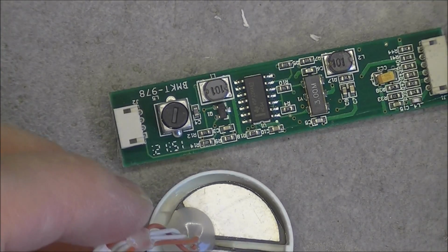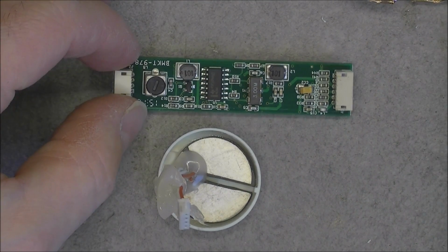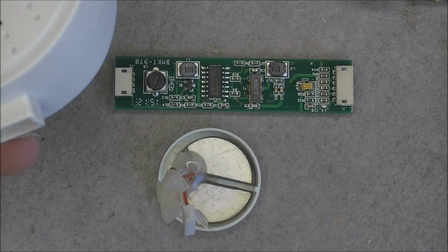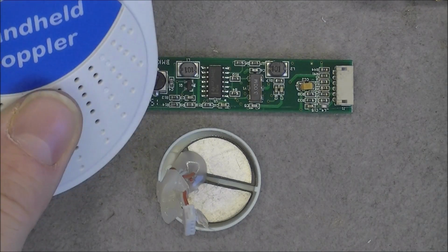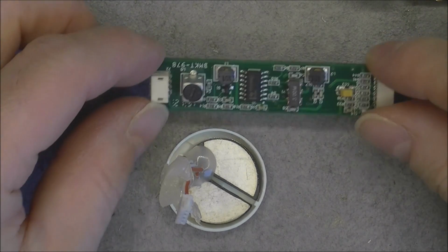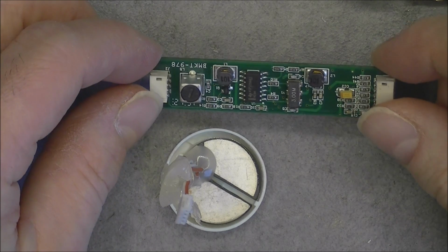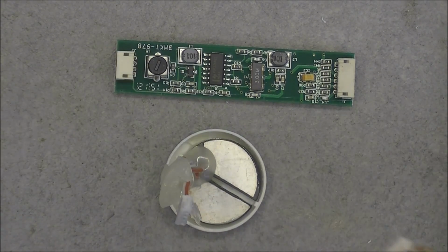Interestingly enough, I don't know if you did notice, but I do not see any microphone, but there is obviously audio output on the device. So it is interesting, in particular considering the little amount of parts in this. So probably the little microcontroller thing does everything to process the signal from the probe and reconstitute maybe some audio output, but as it is not working, I cannot go any further in the test, sadly enough.